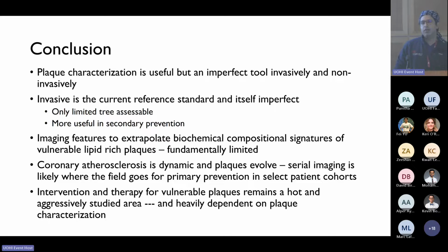Yes, absolutely. Every single software allows you to quantify it. Are you talking non-invasive or invasive? They both do. So the non-invasive one, every single Siemens, GE, Toshiba, all the big makers of CT will allow you to quantify it automatically de novo in their software. They base it on the brightness of the signal. So they'll just call calcium when the signal is above a certain HU and lipid when it's below a certain HU.